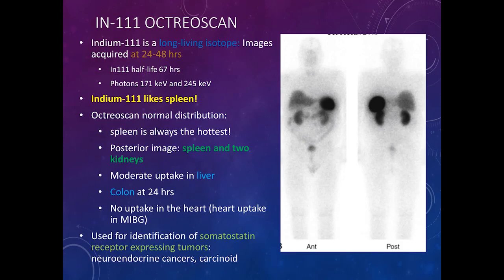So you will have an improved tumor to background ratio, and it will be better visible on the background. If there are especially small tumors in the pancreatic head, sometimes it's difficult to see them on the background of bowel activity, and you might want to add more images.